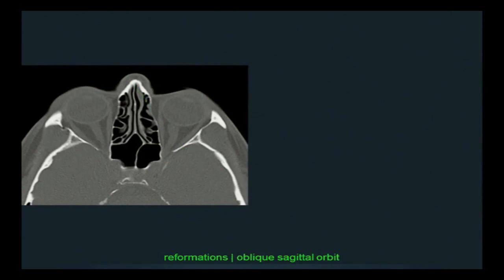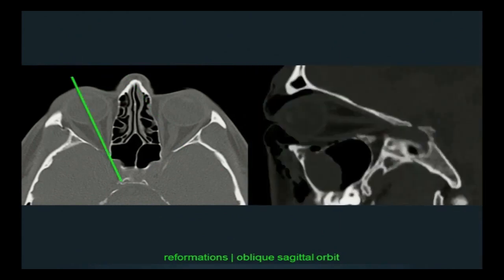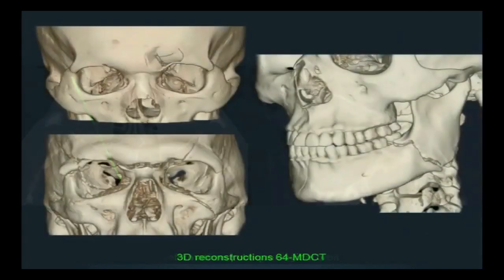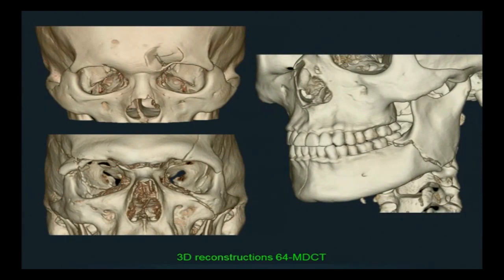For the orbits, I like to do the oblique sagittal when there are fractures involving the orbital floor or roof, so they can see on a pure sagittal the globe and the involvement of the rectus muscles and the optic nerve. And of course, 3D reconstructions really put together the big picture for the surgeons — a global, seeing-the-forest-for-the-trees sort of image.